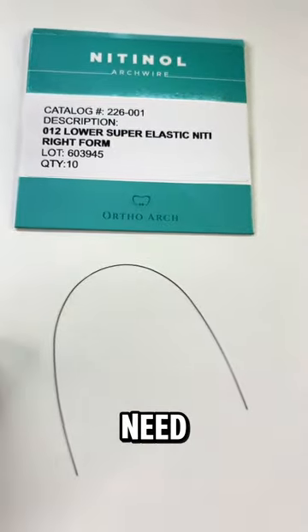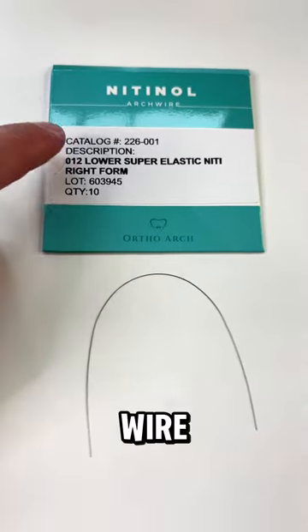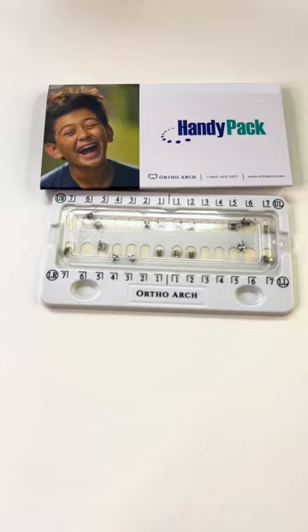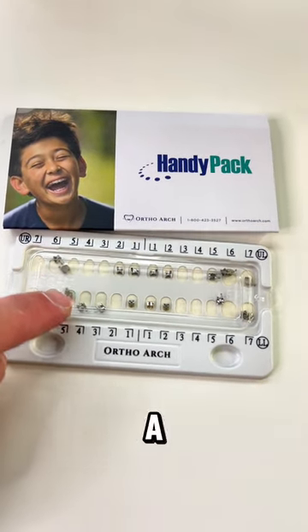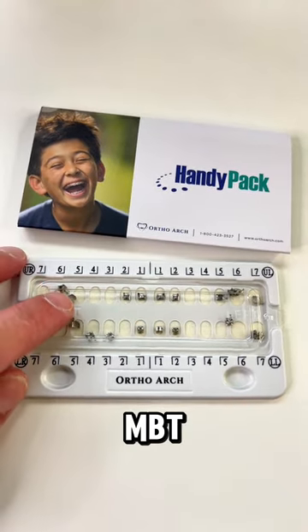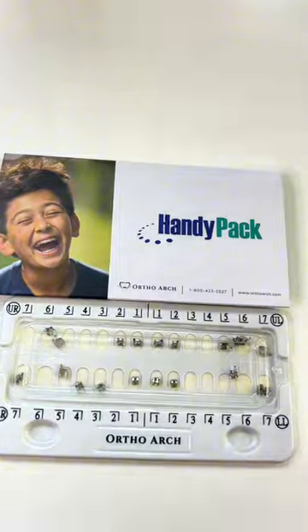You're also going to need some arch wires. This is just a 0.012 nickel-titanium arch wire. You just need two — one for the upper arch and one for the lower arch — to practice tying them in after placing brackets on the typodont. Get either a 0.012 or 0.014 nickel-titanium arch wire; it doesn't matter which size, just get two. You will also need some brackets — any MBT or Roth metal twin brackets will be fine. Get the least expensive metal twin brackets from any company.